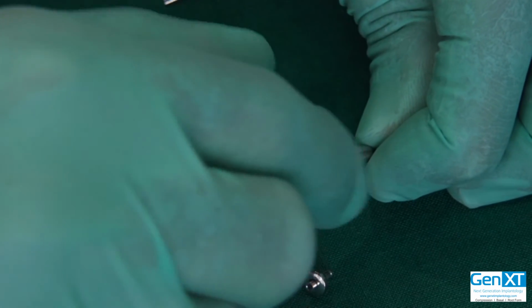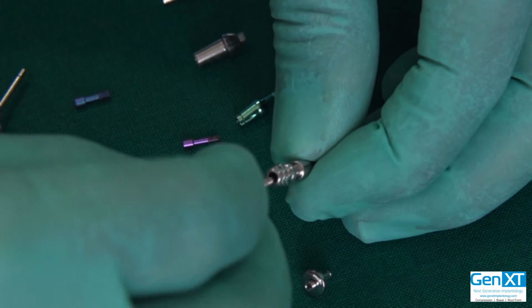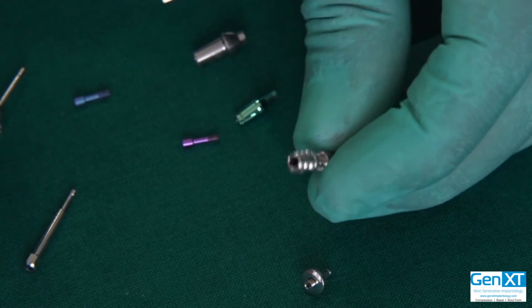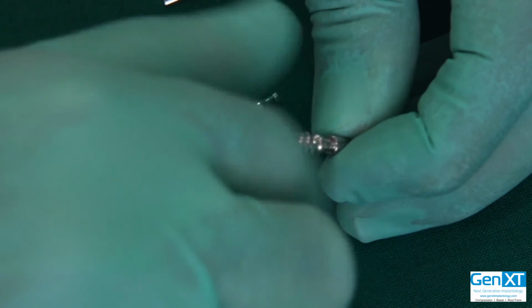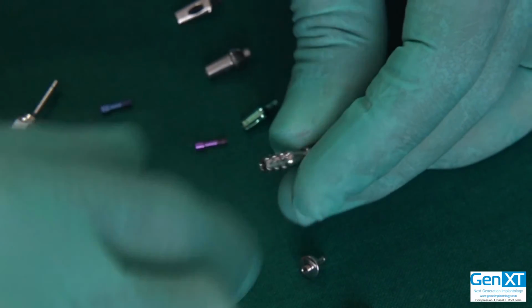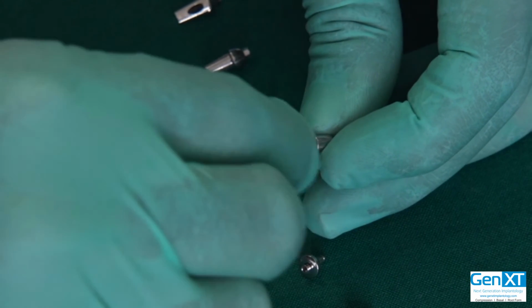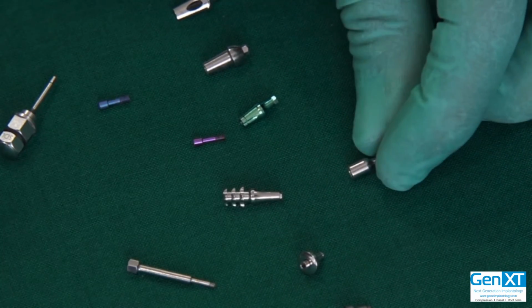Once you have taken the impression, of course, you take the screw out. Then, depending on how tightly you have tightened the screw, you may have to use the remover to pop out the impression post a little, as it may have engaged the morse taper very tightly. The idea is don't tighten this screw very tight so that it catches. Just tighten it by hand until it stops. That's enough. This allows the impression post to easily come out of the implant when you take the screw out. If you tighten it a lot by mistake, then after removing the screw, you have to use the remover and thread that in, so it pushes the impression post out. Is that understood?